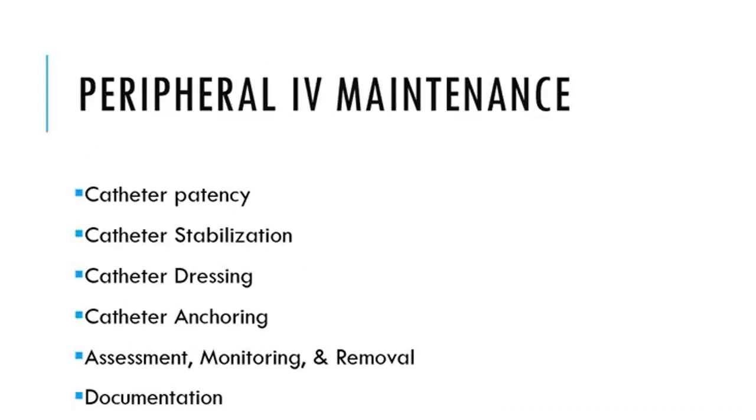So when we think about assessment, it's just like with any other nursing process or any other nursing system, we have to assess that peripheral IV frequently, especially when we have infusion going through it, because at any time the IV could go bad and be non-functional, and then we would need to identify that quickly and get that resolved.